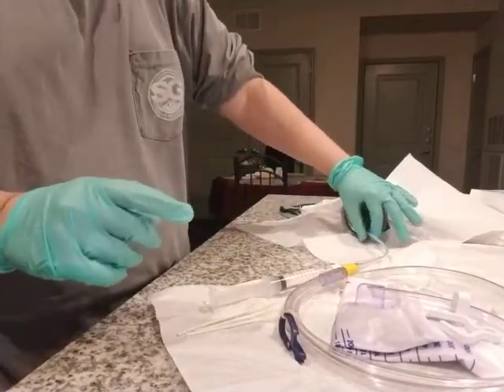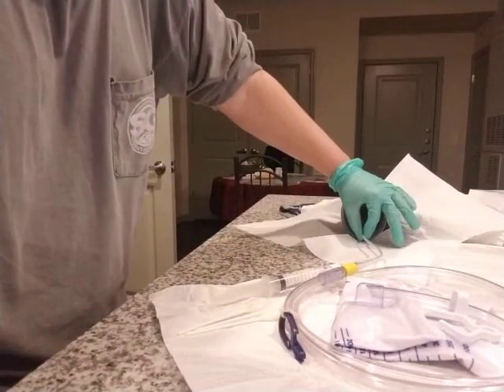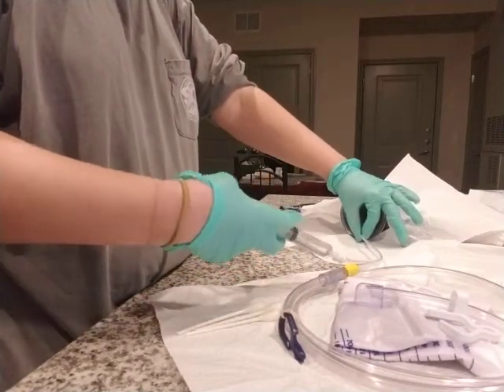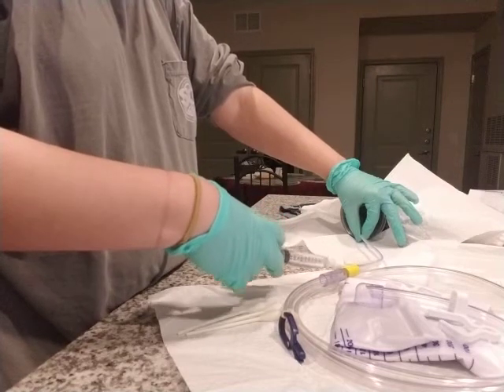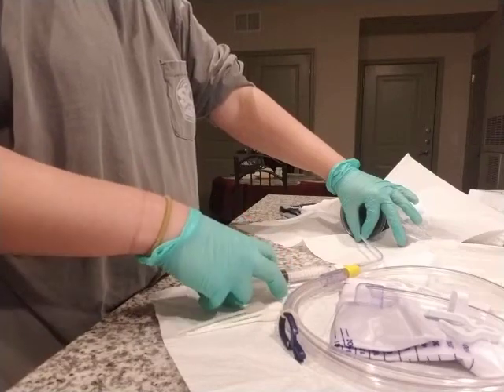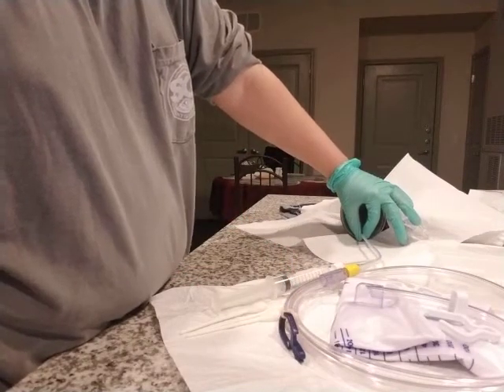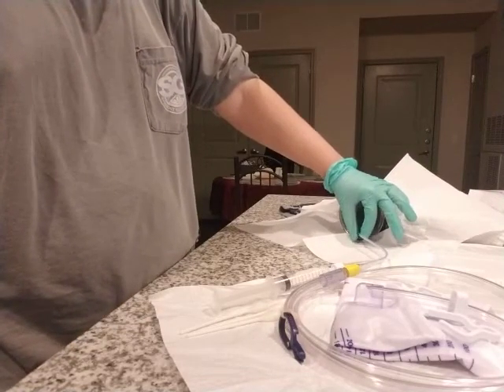I'm now going to hold the catheter in place with my non-dominant hand, and I'm going to fill the balloon with my pre-filled syringe according to hospital procedure. And then after inflating the catheter balloon, I'm going to pull on the catheter a little bit until I have some resistance.